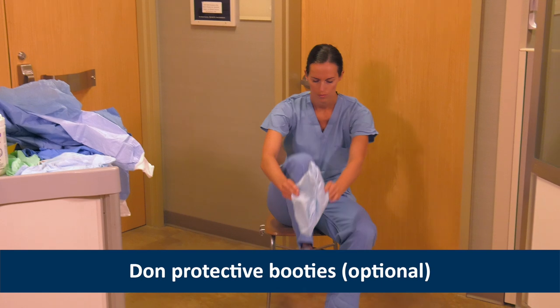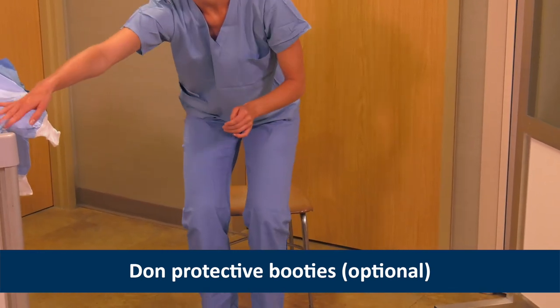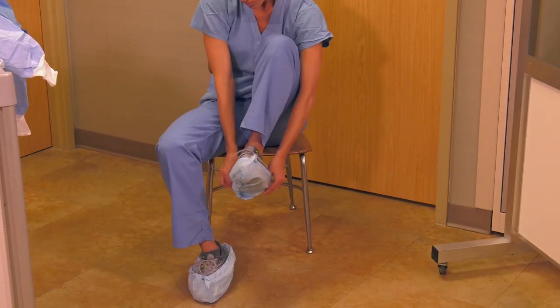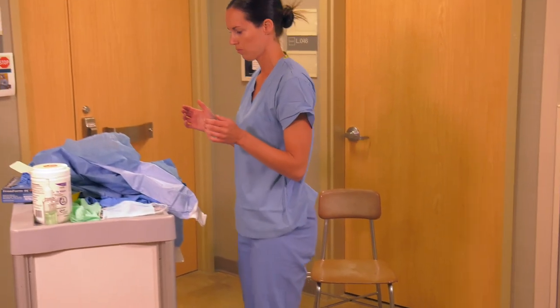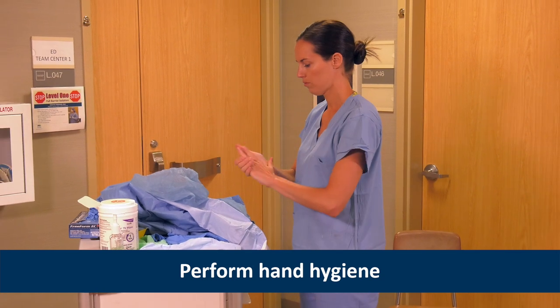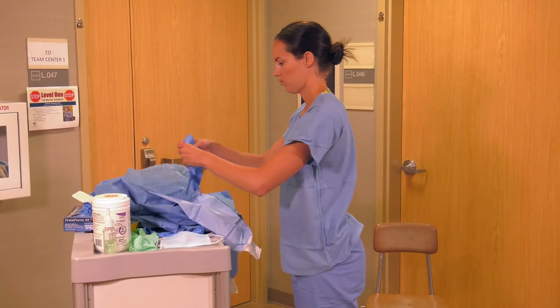Next, Heather puts on protective booties. This step is optional. She then performs hand hygiene with alcohol-based hand rub. Please note that the hand hygiene steps recorded throughout this demonstration are abbreviated for sake of time.